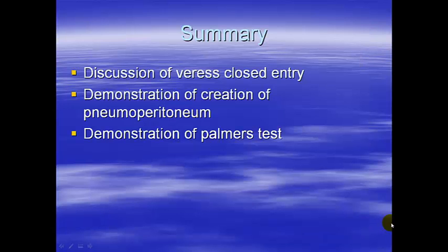In this short video, we have demonstrated the steps required for safe Veress needle insertion to create a pneumoperitoneum, and a number of observations that can be employed to determine peritoneal access. Further ports can then be inserted into the abdomen to continue with the rest of the operation.